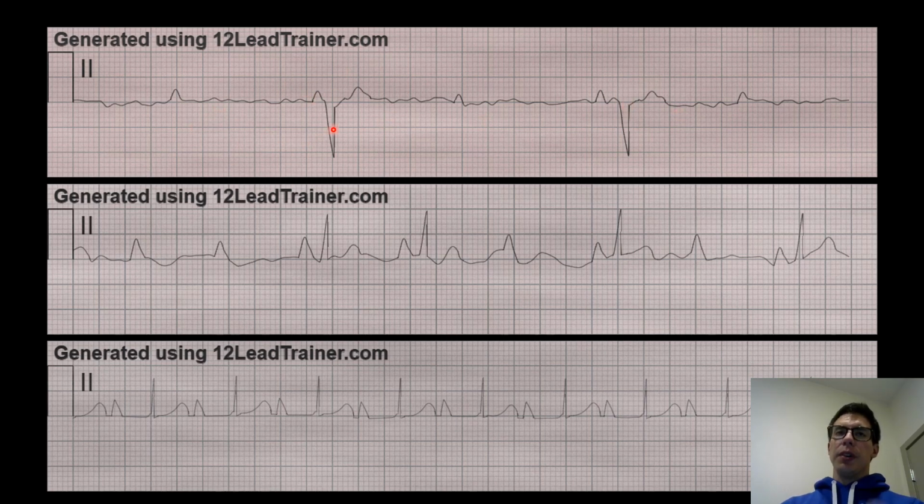Well, they're ventricular, but if they were coming from a ventricular pacemaker, you would expect these to be wider. So what is possible is it could be a second degree type 1, because again, there's not a specific number to the pattern. There just has to be a pattern, so it is possible that there's this one, and then immediately a drop beat, then that one, then immediately a drop beat. Like this could be the same as this one right here. And then it starts over, and then immediately a drop beat, starts over, immediately a drop beat.